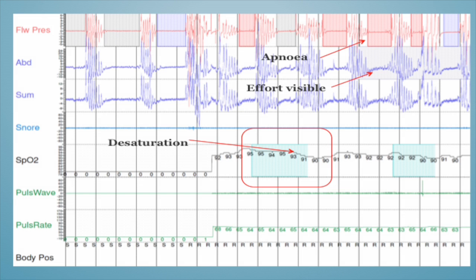You can see where there's effort visible but still no flow. There's a little mixture — they can have some airflow obstruction as well, so you can get mixed pictures. It becomes very interesting when you start validating the data.